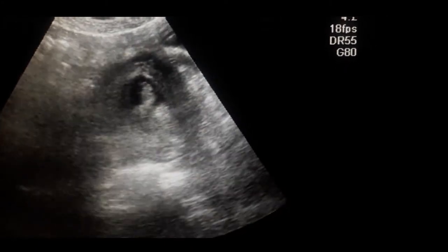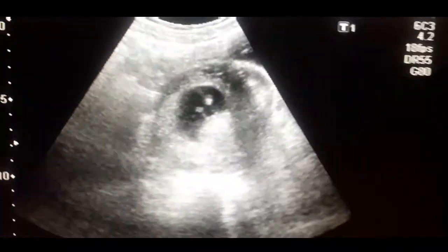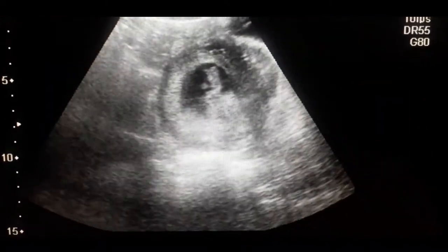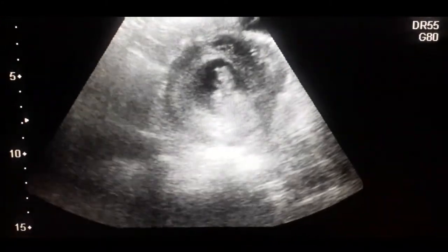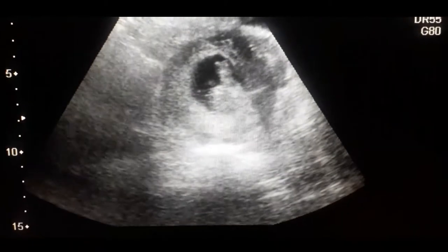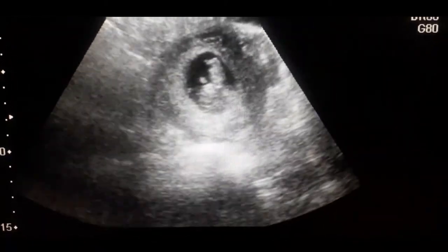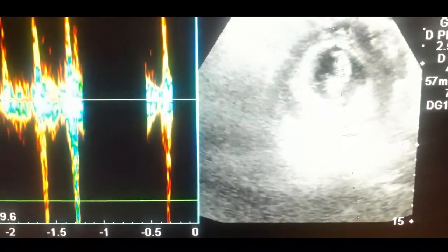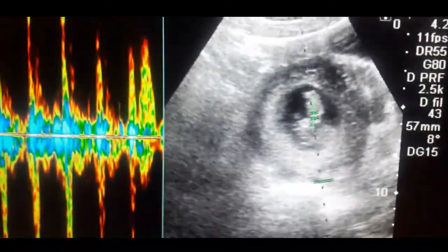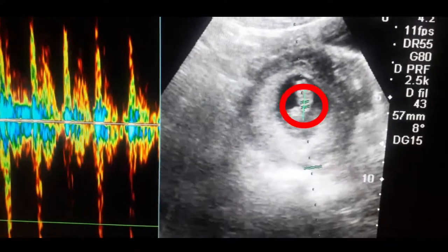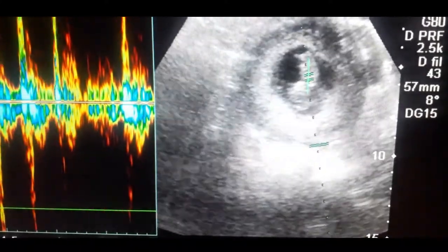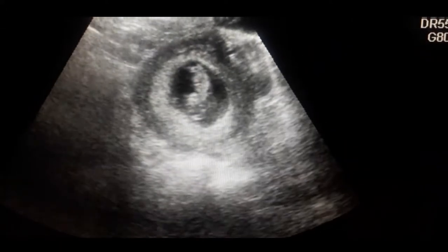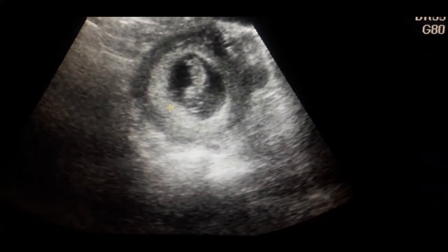Look at the gestational sac — it has a fetus. You can very easily identify the movements of the different parts of the fetus. It is moving. I would like to find the cardiac activity, that is FCA, in the dominant area of the fetus where you can see the pulsation. Cardiac activity is present.